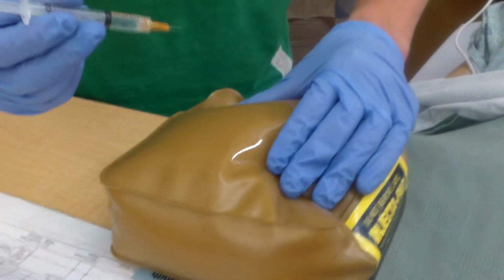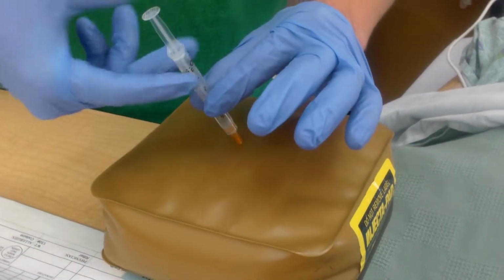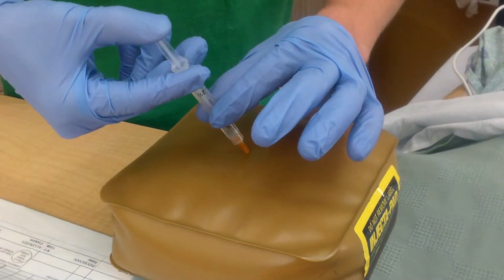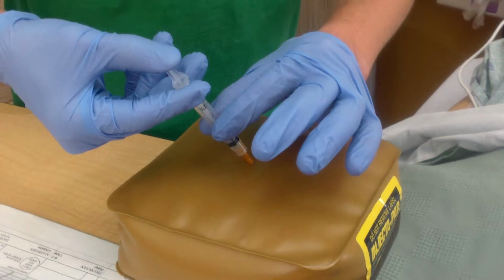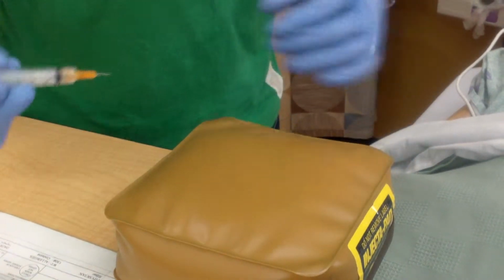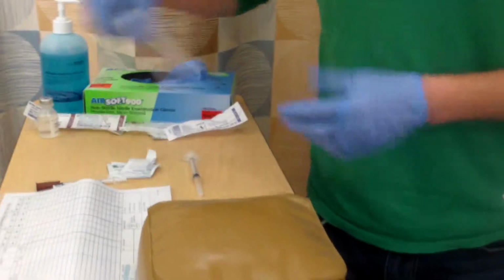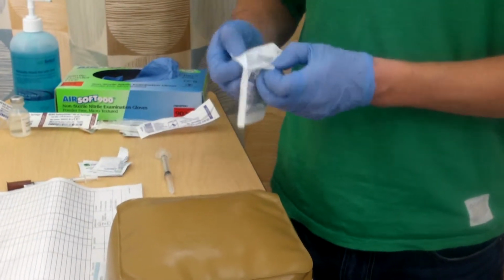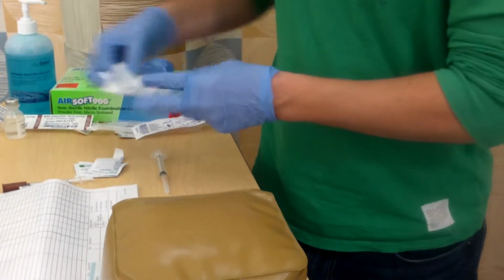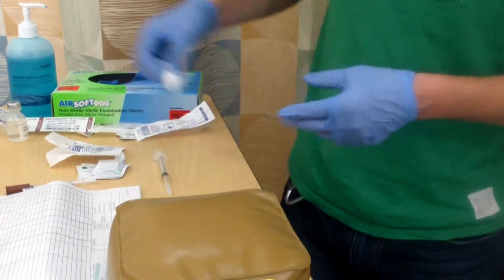I'm going to pinch, and then with a dart-like motion, insert, release, stabilize, and then slowly inject the medication in there, and then take it out within the same motion you did. And this would go immediately into the sharps container. But I'm going to save that for later. And then we'll take another gauze just to see if there's any excess medication that comes out, and just dab that up like that and throw that away.